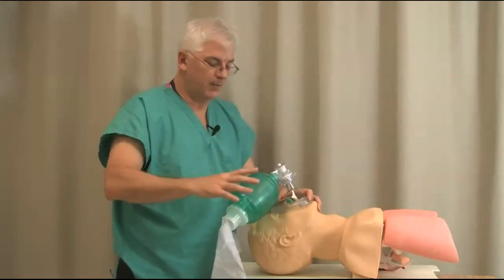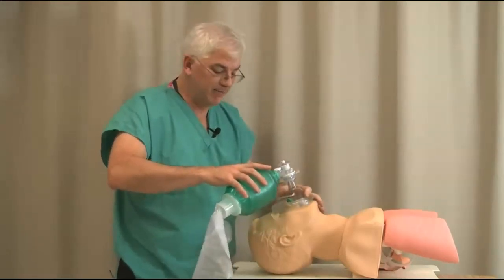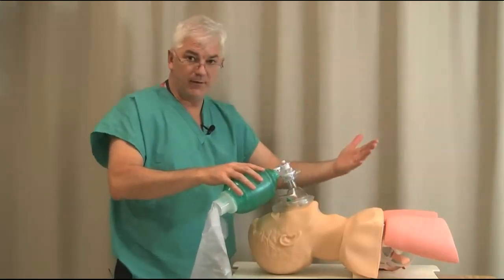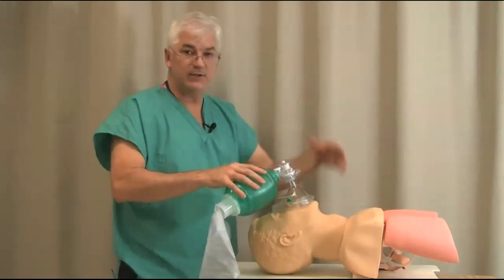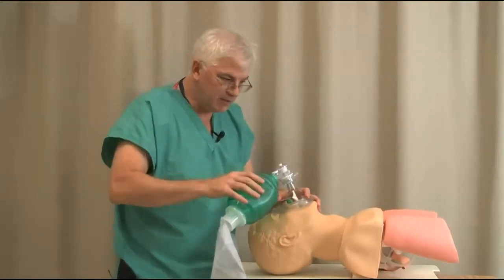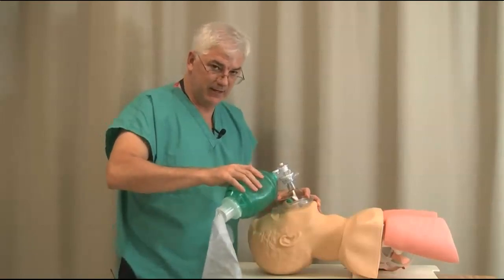Why do I dwell so long on masking? Well, let's say you can't intubate. You might have to mask for a long time. Or you might want to mask until another airway expert comes, or until you can get a fiber optic in the room. So it's really worth spending some time making sure you really can mask ventilate a patient.